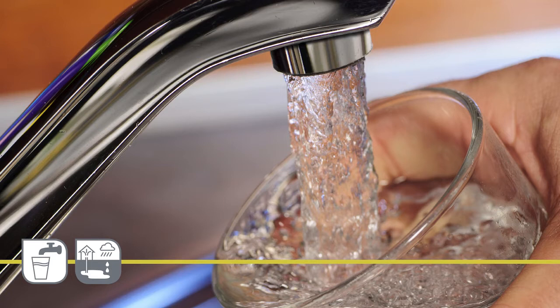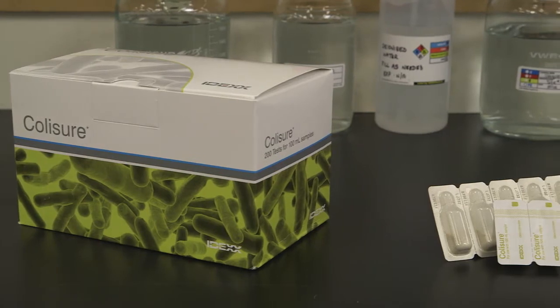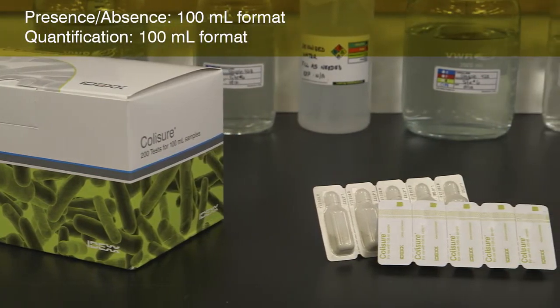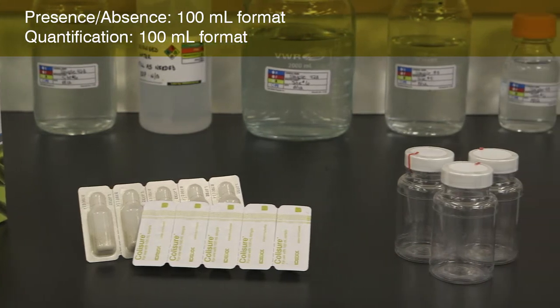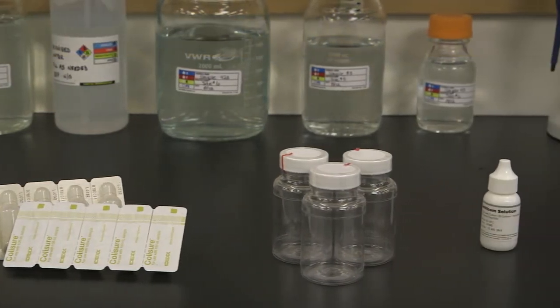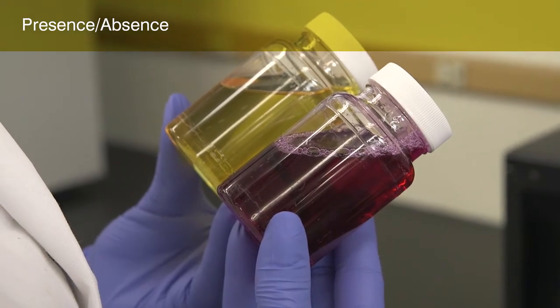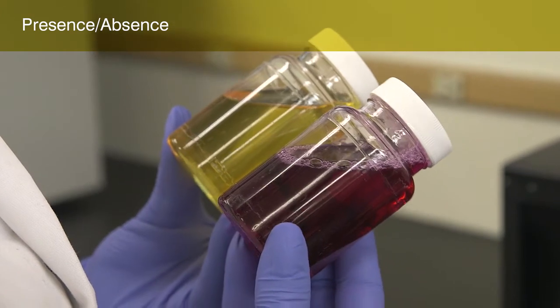The ColiShore test is available in a 100 milliliter format and has a read window of 24 to 48 hours. In the next few minutes, you'll learn how to use the 100 ml ColiShore test for presence absence detection and for quantification using the QuantiTray system.